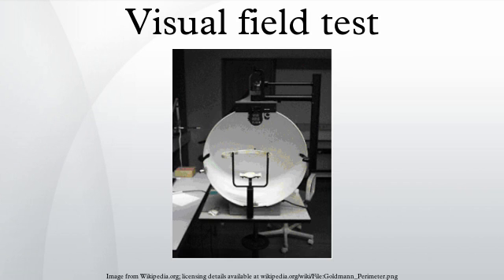Perimetry or campimetry is one way to systematically test the visual field. It is the systematic measurement of differential light sensitivity in the visual field by the detection of the presence of test targets on a defined background. Perimetry more carefully maps and quantifies the visual field, especially at the extreme periphery of the visual field. The name comes from the method of testing the perimeter of the visual field. Automated perimeters are used widely, and applications include diagnosing disease, job selection, visual competence assessment, school or community screenings, military selection, and disability classifications.